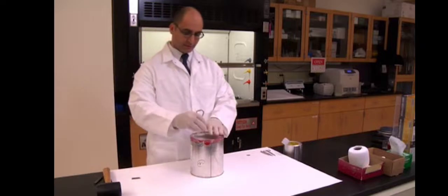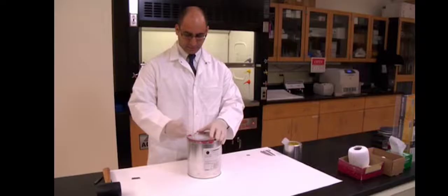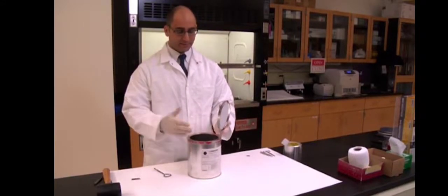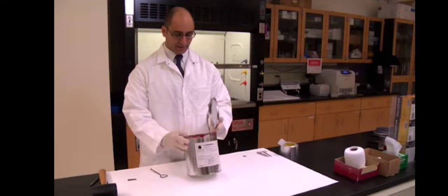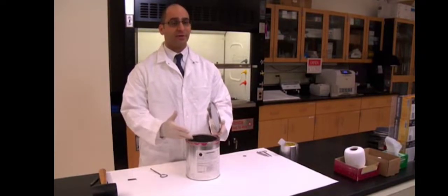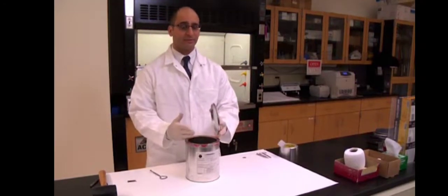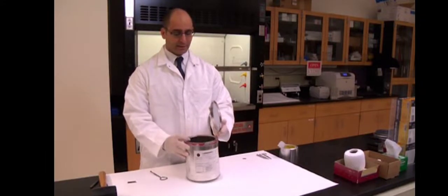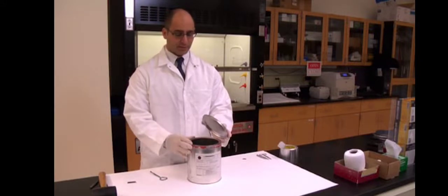Cut open the seal, open the can. At this stage, I would note the contents of what's in the container because that'll affect how you're going to analyze things later on. You can also, at this point, note whether or not there's any obvious odors. If there's a very strong gasoline odor or if it's a weak gasoline odor, that might affect how you're going to analyze things later. If there's no odor at all, it's also something that we would want to note.